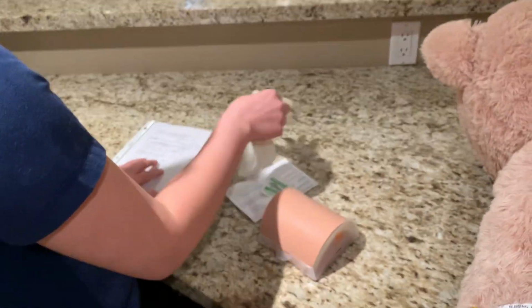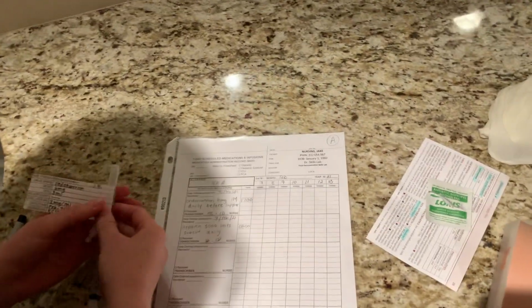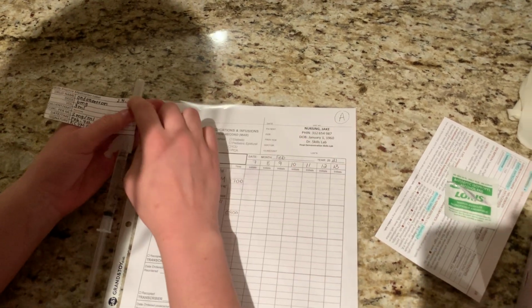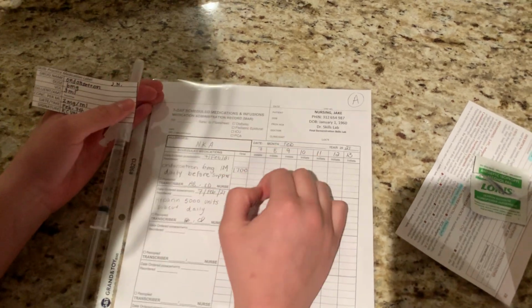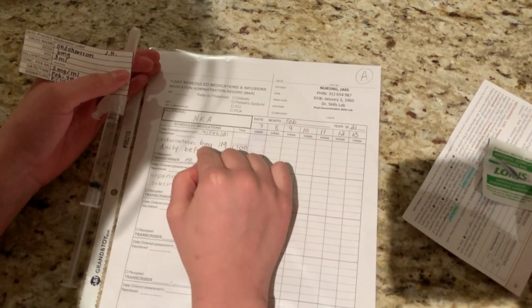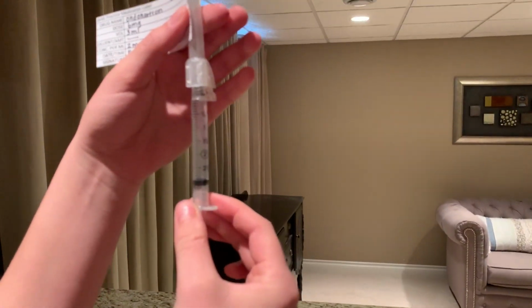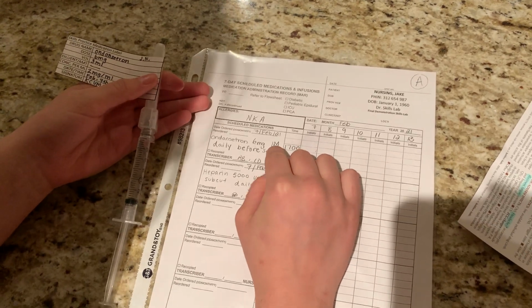Okay, Jake, before we get started, I'm going to do my third check of my medications. We have the right patient, Jake nursing, right medication, ondansetron, right dose. We have 6 milligrams, which is 3 milliliters, which is what I have here. Right route, intramuscular.